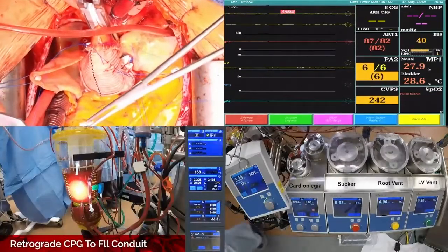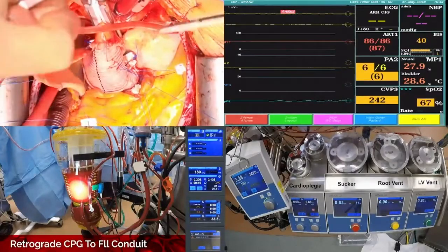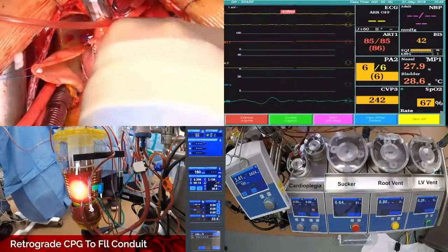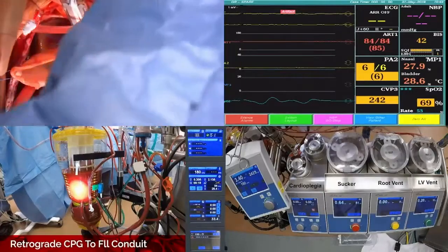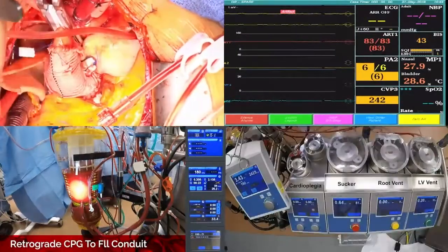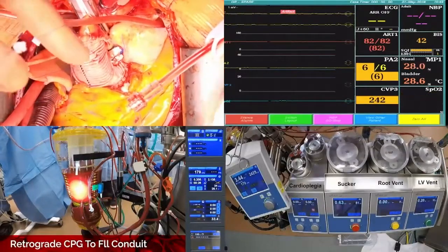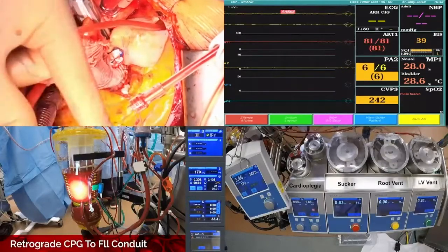And you know, when you say back wall, you got to remember, depending on who's watching, a surgeon's going to understand that. Maybe somebody as old as me might understand that, but most people are not going to. It's snagging the other side of the conduit where it's going to pinch it off, and that's just bad technique from a surgeon standpoint. That's like having a garden hose with a clamp over it. Correct. Yeah. Part of it.